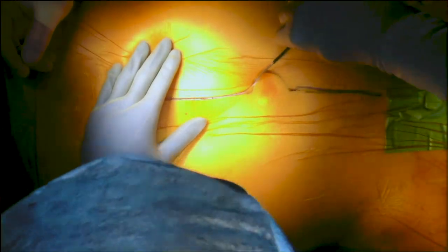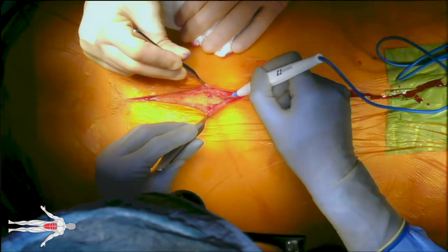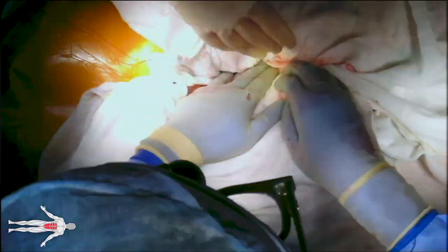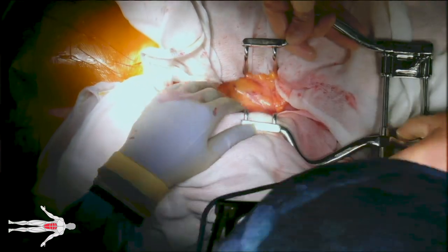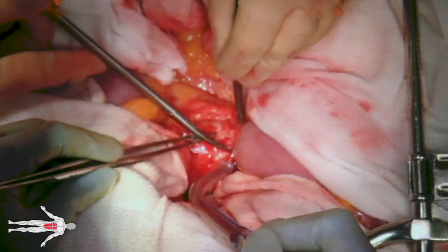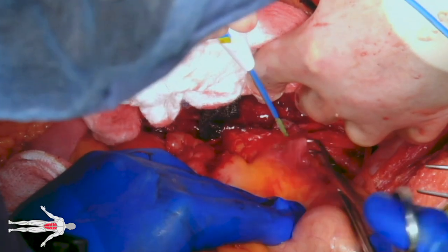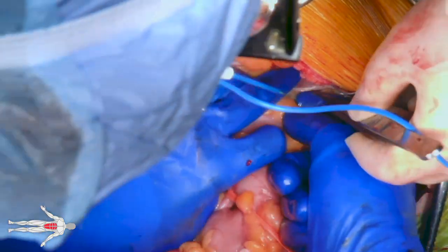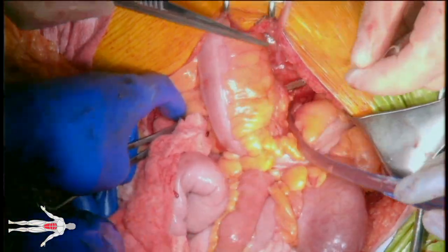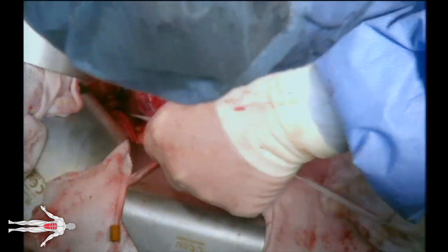A midline laparotomy is made using a 15-blade scalpel. Dissection is taken down through subcutaneous tissue using electrocautery. Upon entry into the peritoneum, the transverse colon is reflected cephalad and wrapped in a lap towel. The small bowel is eviscerated and also wrapped in a similar fashion, and a Balfour retractor is placed. The retroperitoneum is then incised and dissection is continued directly on top of the aorta, freeing retroperitoneal attachments in a caudal fashion. The descending colon is then reflected medially and the line of Toldt is incised to expose the left common iliac artery, which is circumferentially dissected and controlled with umbilical tape. A retrocolic tunnel is then created and preserved also with umbilical tape. The aorta is then circumferentially dissected and controlled.